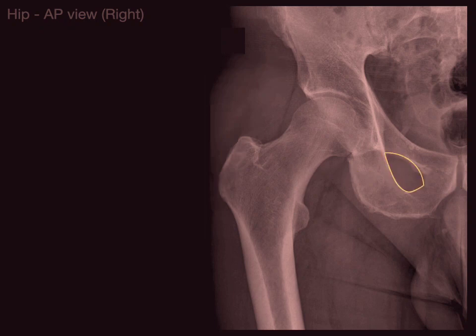This opening or hole right there is called the obturator foramen. "Obturator" means stopped up, because there is a membrane that closes most of it, except for a small opening at the top where the obturator nerve, artery, and vein come through. That obturator foramen is a very characteristic opening.